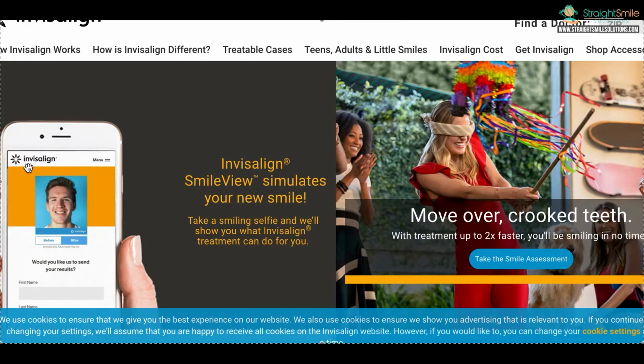And then if you're not seeing your patients right now because you're closed for COVID, you're going to have to mail them the retractor. So it's one more step that you have to do, which is not a big deal. But trying to get retractors right now through Amazon or eBay, it's going to take a good month. So they said you can use spoons, but that's fine too. I mean, you have to give them the information.